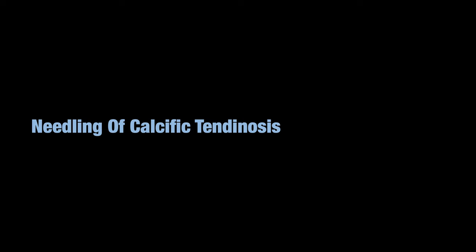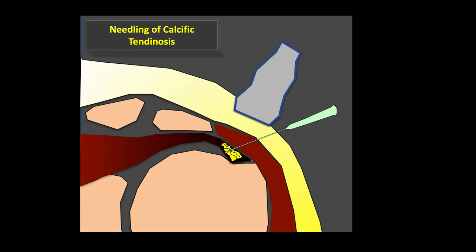Needling of calcific tendinosis is increasingly requested. First, scan the patient to identify the calcific deposit — that is where you'll insert the needle. The procedure has three basic steps: Step one, inject local anesthesia — 2% lignocaine — into the subacromial subdeltoid bursa and overlying skin. Step two, insert the needle into the calcium, break it up with multiple attempts, push in saline and lignocaine to fragment it, and aspirate the dissolved calcium through the same syringe. This is known as calcium barbotage.